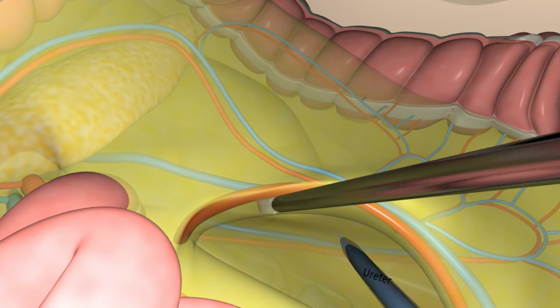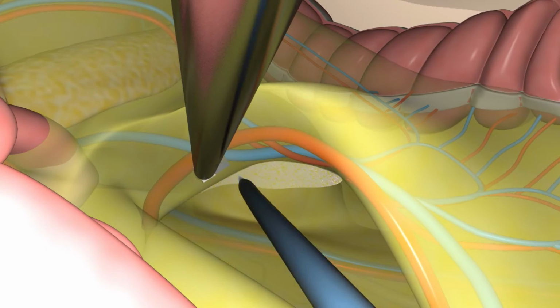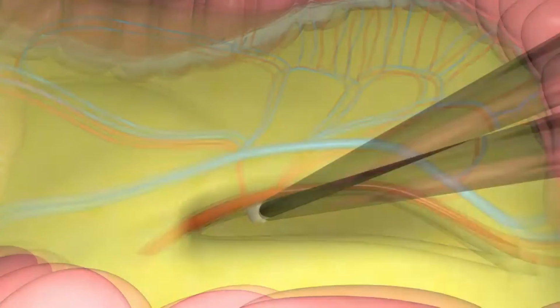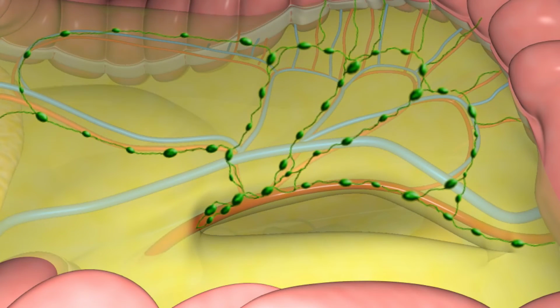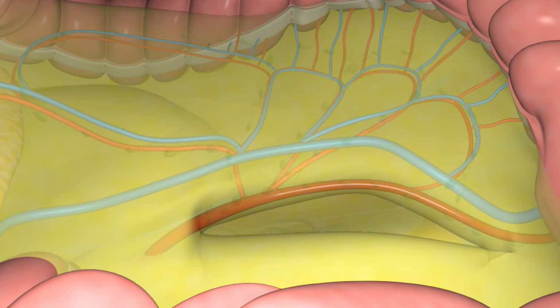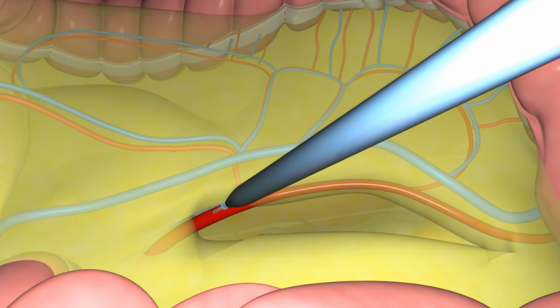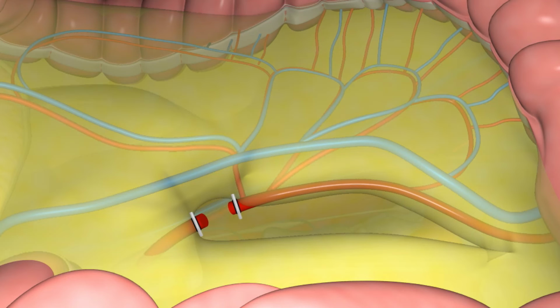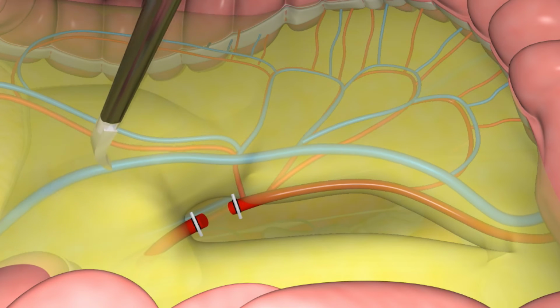The ureter is covered by parietal peritoneum and just medial to the gonadal vessels. The dissection continues posterior to the sigmoid mesocolon, going laterally. This dissection at the origin of the inferior mesenteric artery involves a risk of injury to the autonomic nerves situated on the left border of the inferior mesenteric artery. A meticulous dissection of the artery helps to avoid this risk.